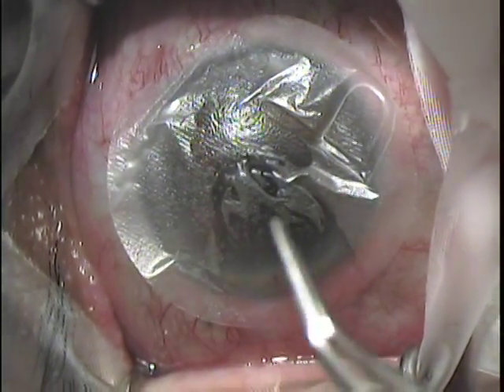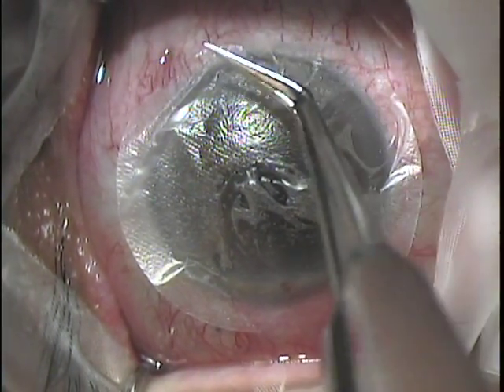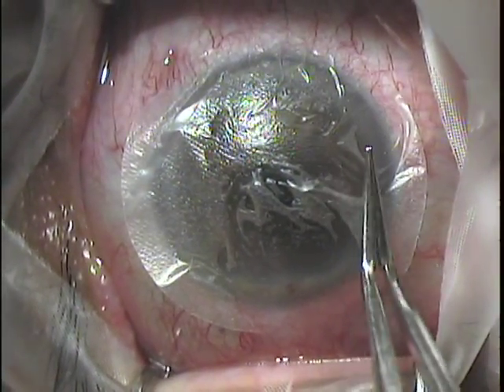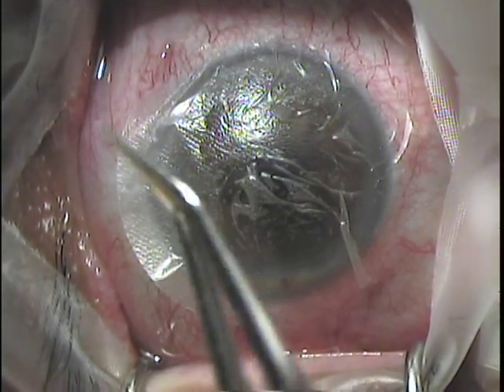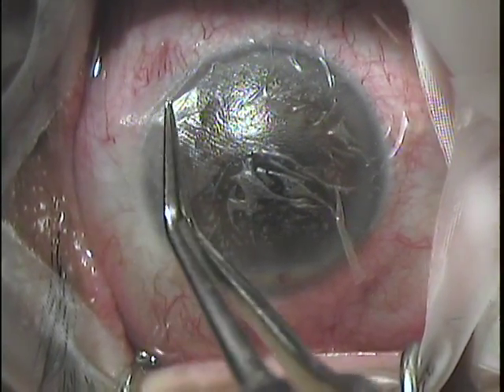You can then use the forceps to smooth out the membrane, making sure that it stays centered on the whole cornea, even though the first point of contact was over the epithelial defect.